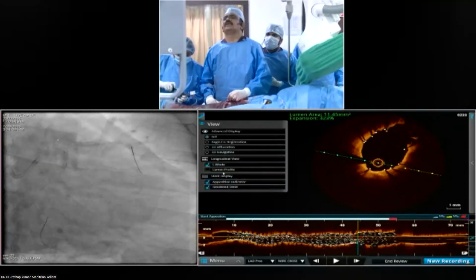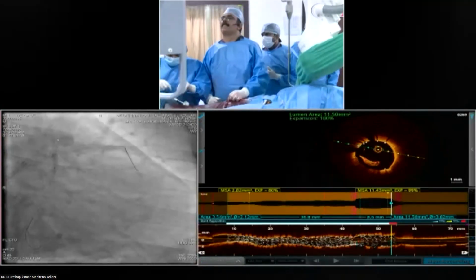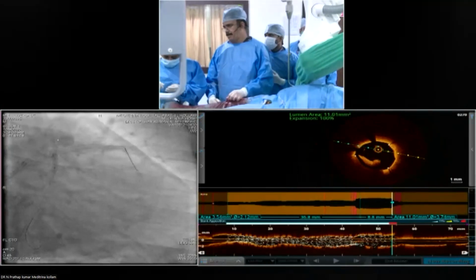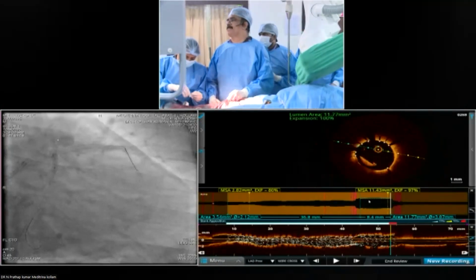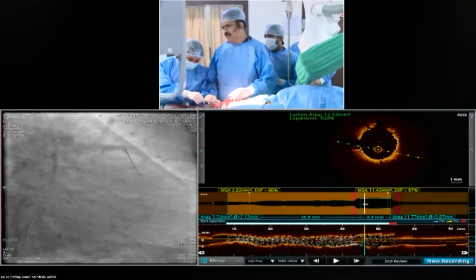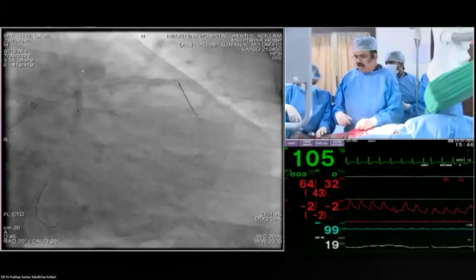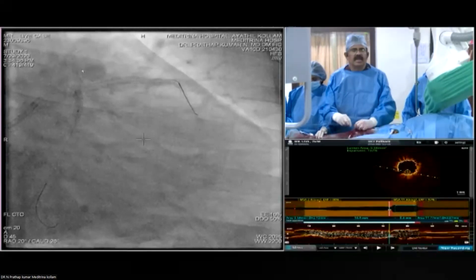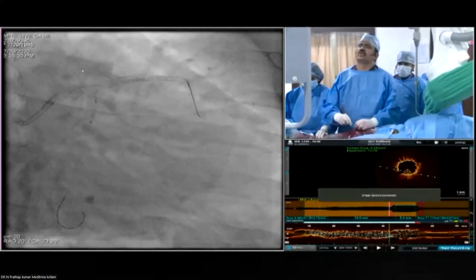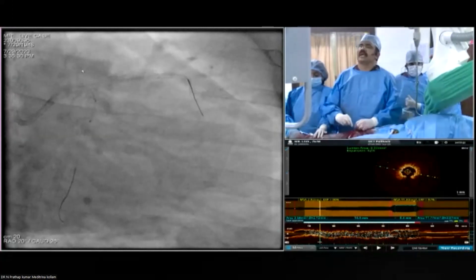The equal result. Deflate. Can you just take a 4 millimeter balloon? Well, one thing, before kissing, there is side branch dilatation, but NC balloon at high pressure is mandatory. No, actually, we went up to 15, sir. That is actually the point. 2 balloons go with 15 separately, then both the balloons should go 8 or 10 or 12 according to your choice. But personally I feel that you should not go beyond 12, because it is not good, the carinal shift will happen.